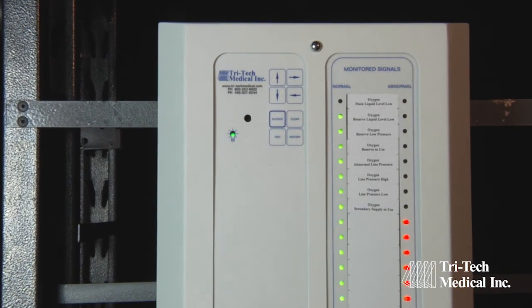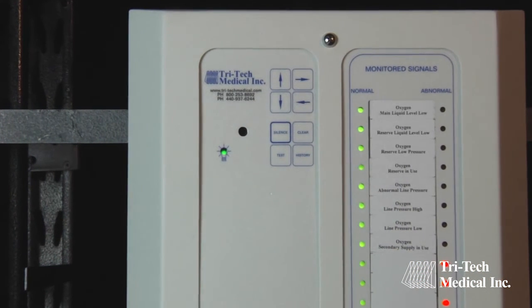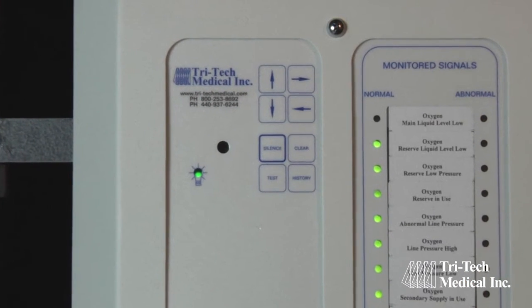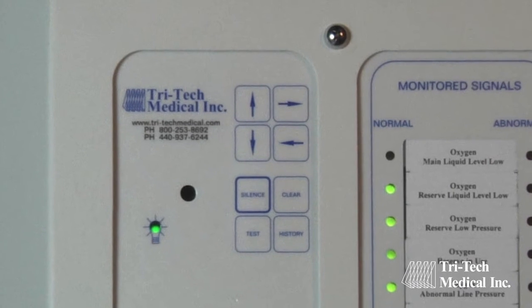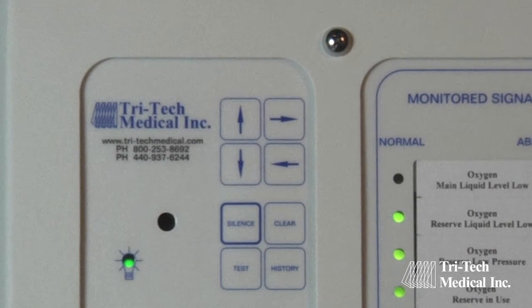When the alarm panel is in the program mode, the arrow buttons take on secondary functions. The up and down arrow buttons are used to toggle between the red or green LED being illuminated. The right arrow button is used to move on to the next alarm signal point. The left arrow button must be used to save the programming option after it has been selected.